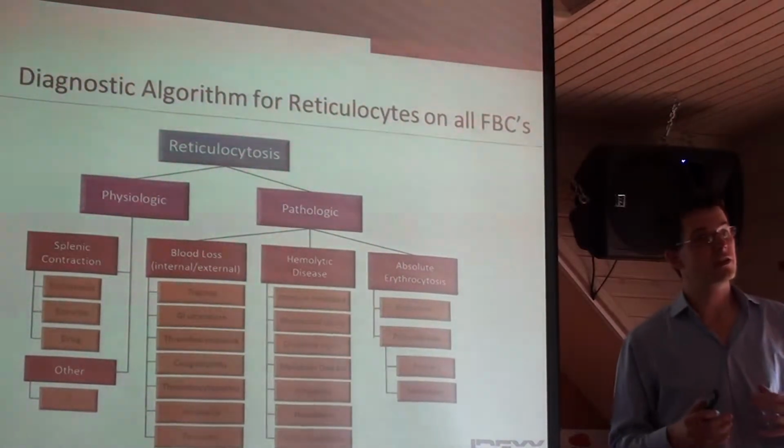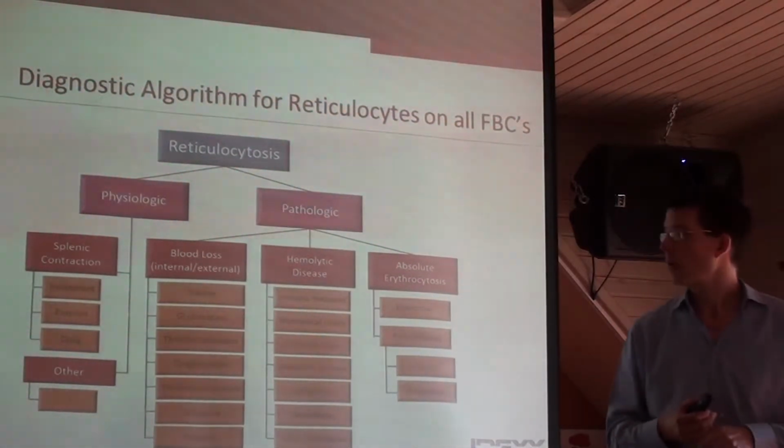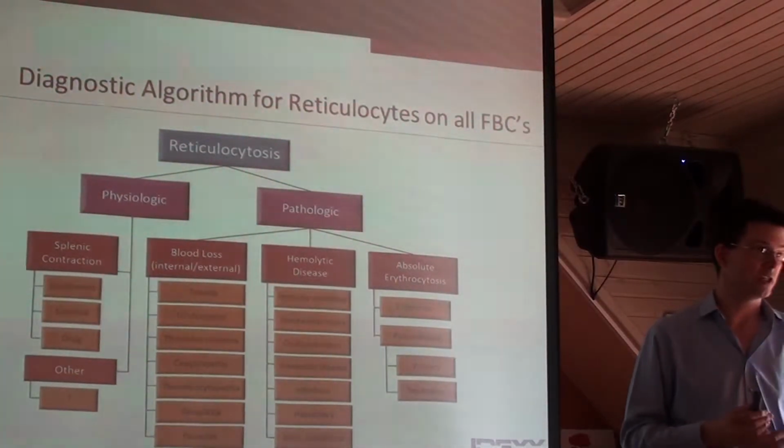So with a canine patient that becomes very excited during venipuncture and blood sampling, we may well see a profound increase in the reported concentration of reticulocytes.